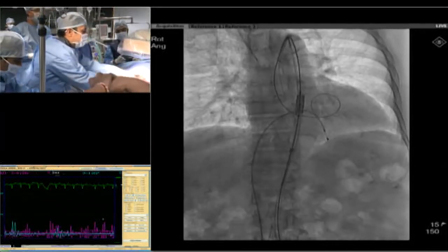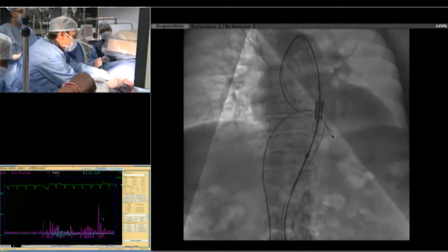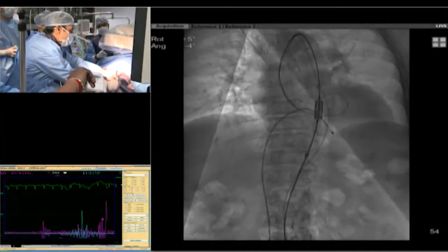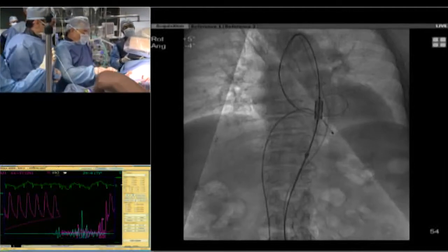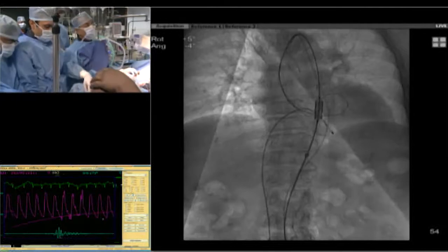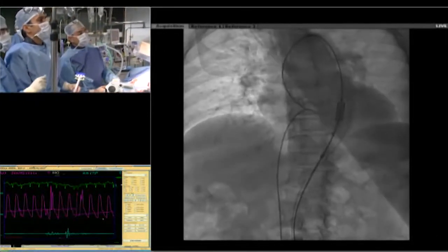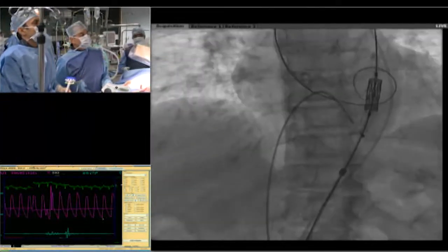And I want the wire now to go into the root of the... I think we are already there. Okay. Can I have a bit of contrast in my hand? Go, Elio. Elio, please, same Elio, which is the co-planar view. Zoom now. Mag up. Mag up. More. Good. This is good.